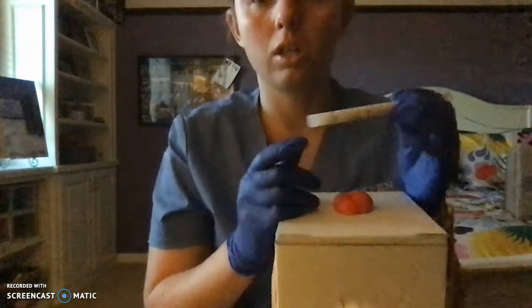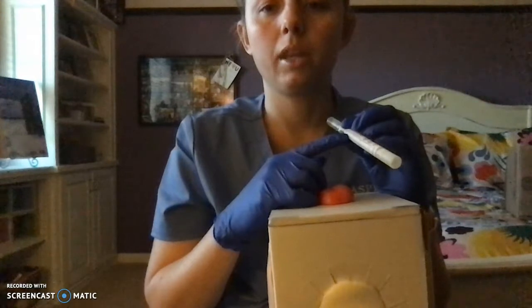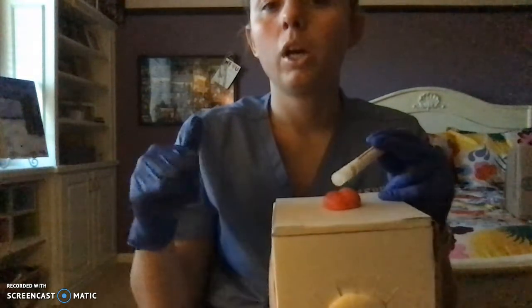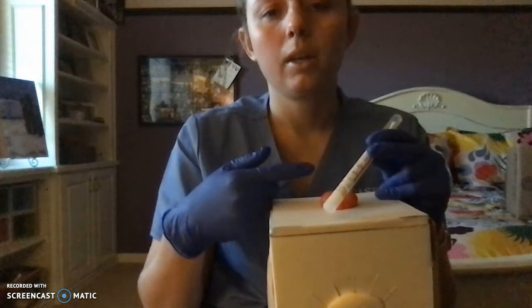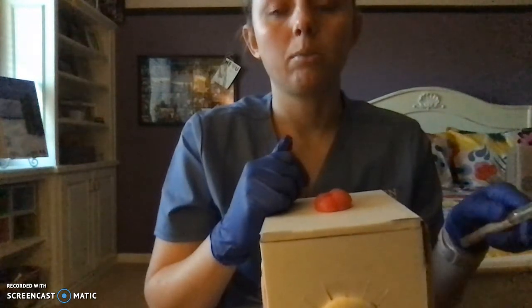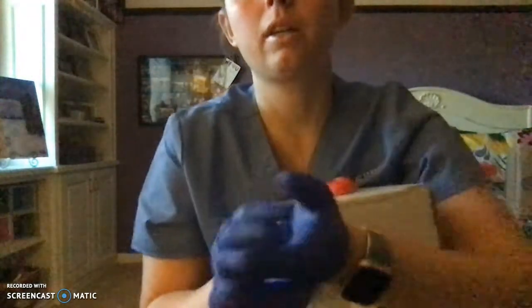You're gonna make sure that you printed out the label and make sure that the name that she said was the same name and the date of birth on here. You're then going to scan the patient's wristband and then scan the specimen swab and put it into a hazard bag and then take it down to lab. I would document that I did that as well.